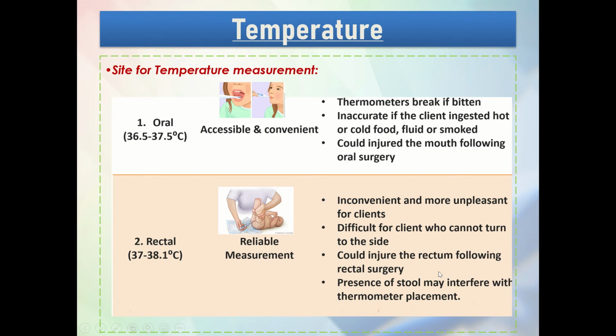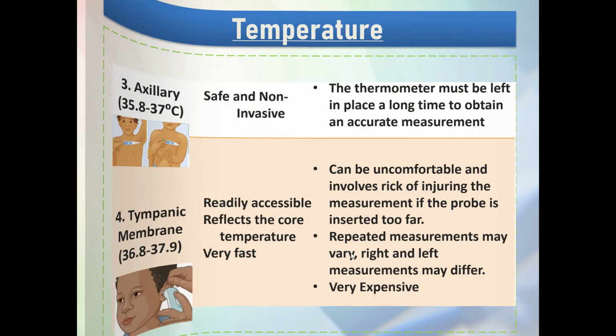It could injure the rectum following rectal surgery. So, definitely, hindi natin ginagamit yan kapag nagkaroon ng rectal procedure sa pasyente. And then, if there is a presence of stool, it may interfere with thermometer placement. So that is the first two, oral and rectal.